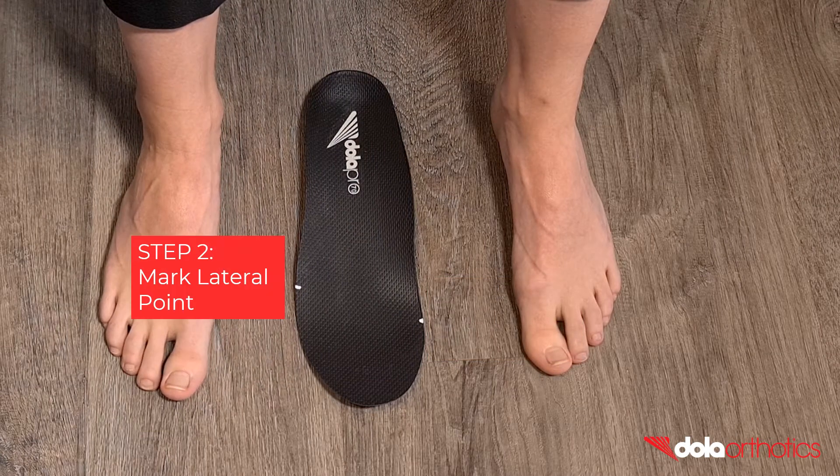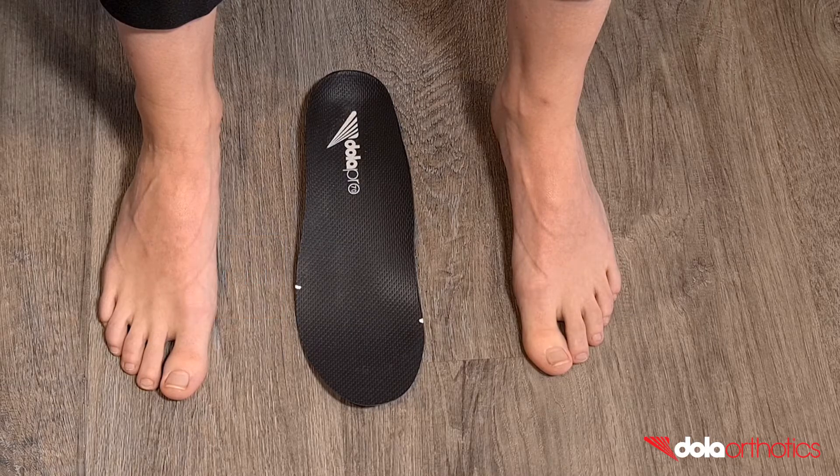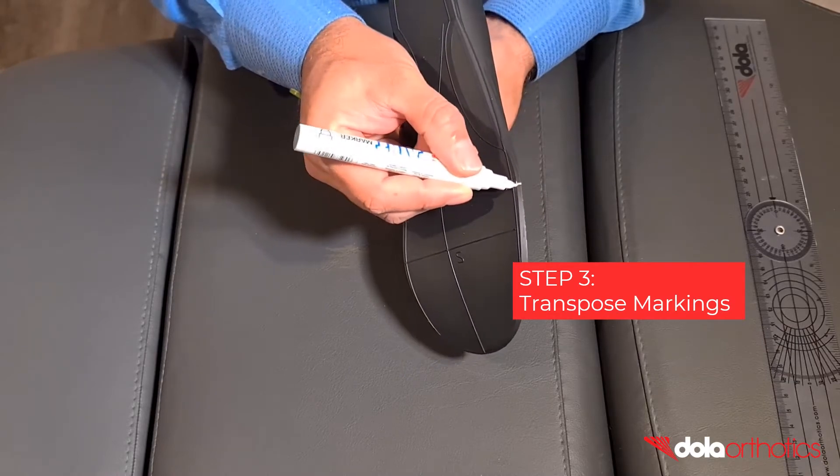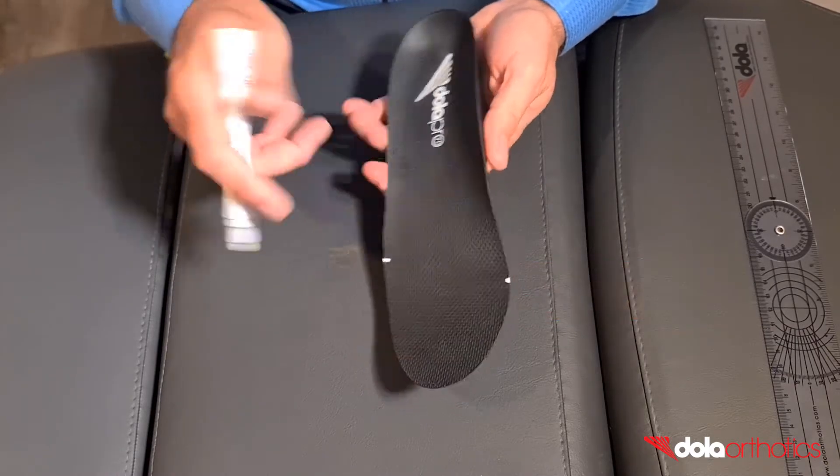Step 2: Mark the lateral side of the extension. This will most commonly be the sulcus of the fifth digit. Step 3: Transpose the medial and lateral markings onto the plantar surface of the orthotic.